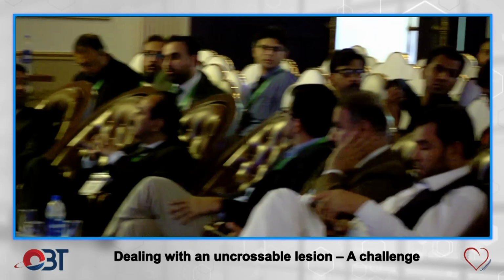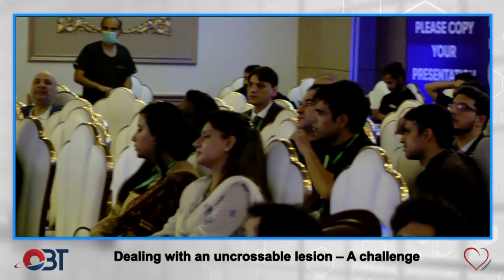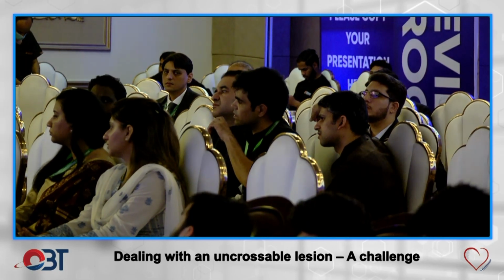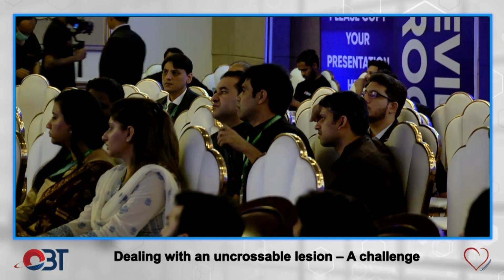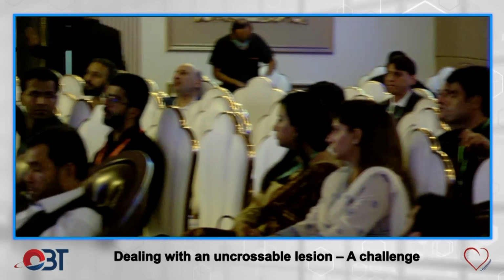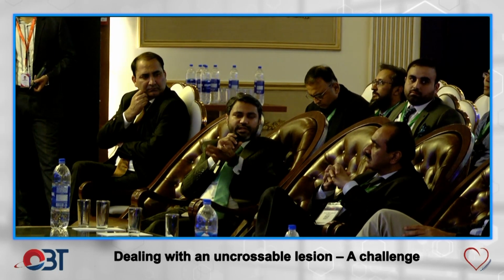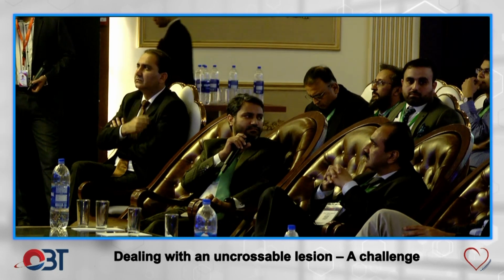What were you ablating with the rota? Was it calcium? Yes, it was calcium. There was no stent beforehand, and I don't think the calcium was coming through the struts into the lumen. This was not a case of ISR. This was a case of heavy calcium inside the vessel as well as extrinsic calcification, as was visualized in the LAD. The LAD was unobstructed, but there was heavy calcium. It was visible on the first angiogram.